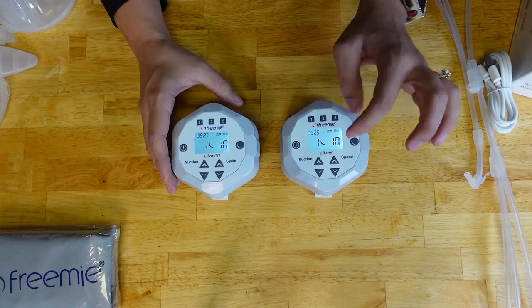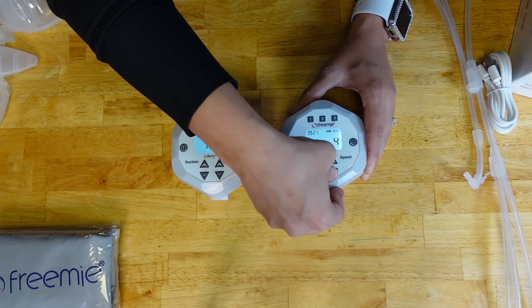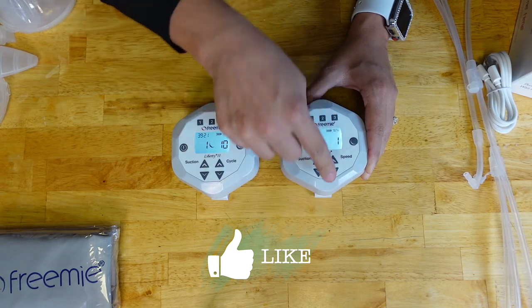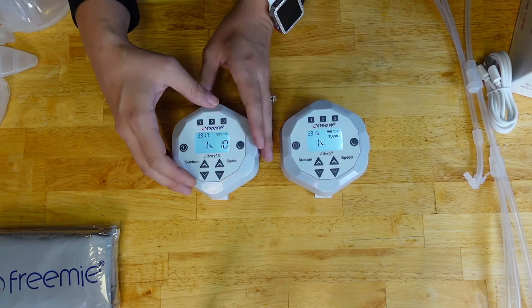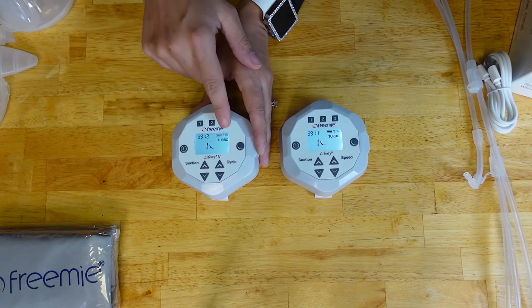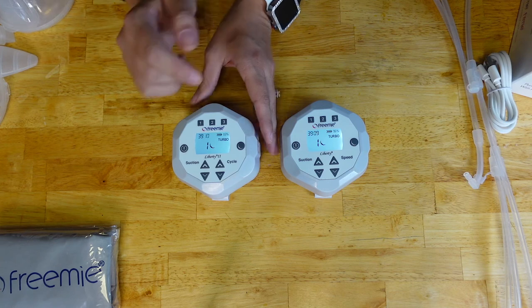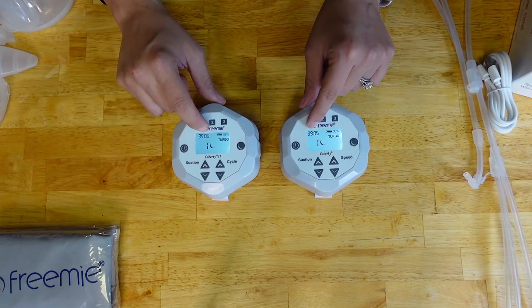The difference between the two is that on the Liberty 1, once you decrease the number all the way back to 1 and go one more lower, that's when the battery goes to turbo. On the Liberty 2, once you hit 10 and press the up function, that's when it hits turbo. So they just had it opposite.